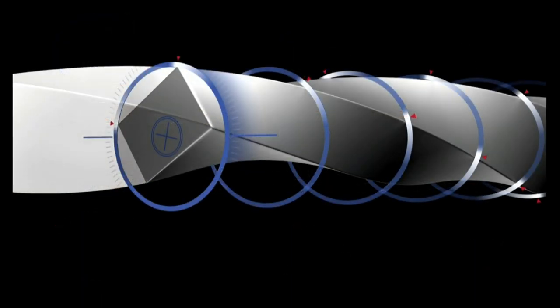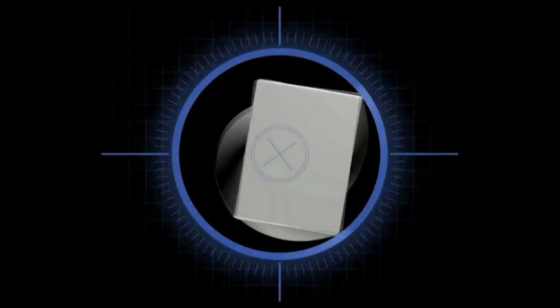I'm going to show this to you in animation in a second, but I want to show you what to focus on. At the end on the left is ProTaper Next, the horizontal cross section, and again you can see with the small red arrows, the 2 points of contact. If you go 2 circles down, you can see a red arrow about in the middle, so you can see 1 point of contact, and if you follow that down further, you see where it's contacting and further. And this will rotate as we see it in animation.